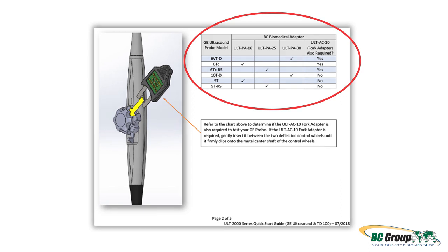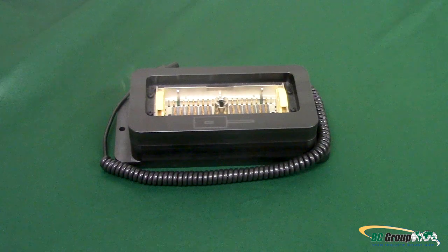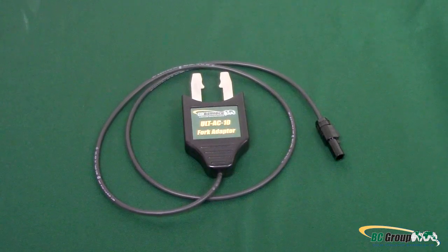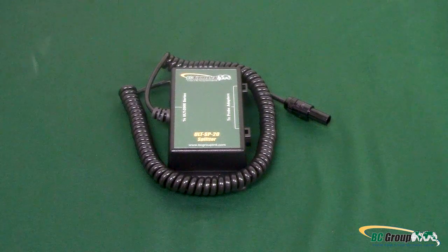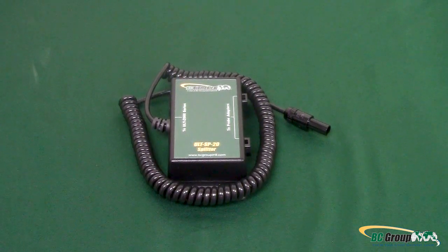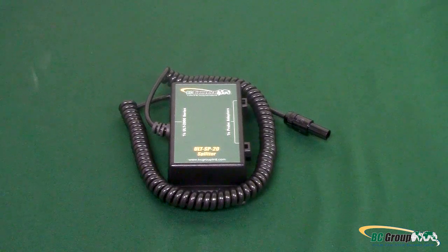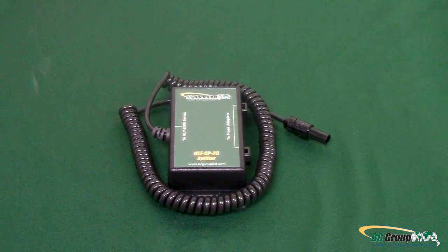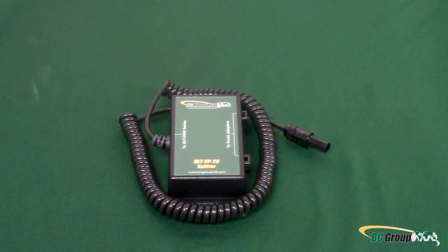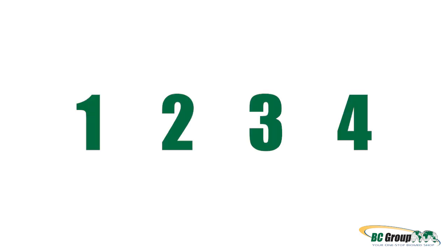For this demonstration, we will be using the ULT PA30. We will also need the ULT AC10 fork adapter and the ULT SP20 splitter. The ULT SP20 splitter is only required if using the ULT AC10 fork adapter. If the fork adapter is not used, the probe adapter cable may be connected directly to the ultrasound leakage tester.